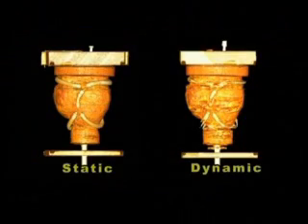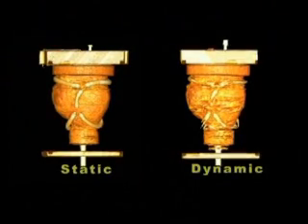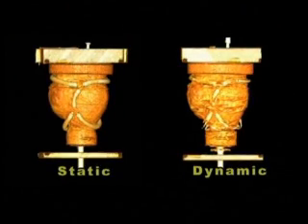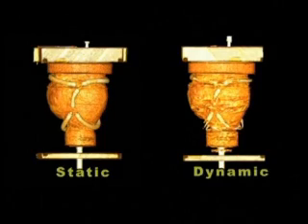It is critically important in cardiac CT applications to be able to accurately delineate the coronary vessels. In this image of the cardiac phantom, which is suffering from motion artifacts, the vessels modeled on the cardiac surface cannot be delineated clearly. This is an ongoing challenge in cardiac CT imaging.